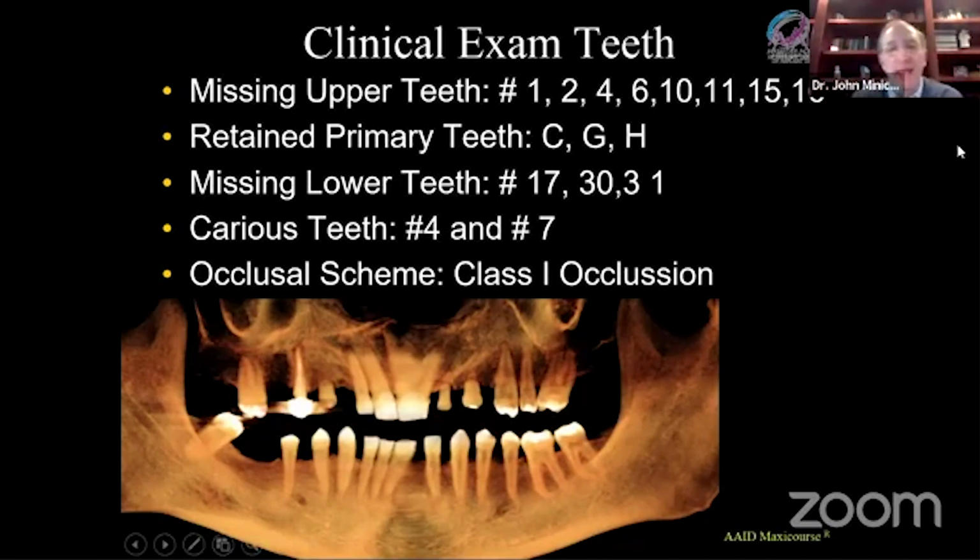Anything else you guys like that? How about some bone diagnosis, guys? I'm always impressed with those candidates that come before the board, and they give me a division of bone or a classification of bone. Anybody want to give me a classification of bone on this patient? From a chat. If not, I'll start just laying out some of the stuff.